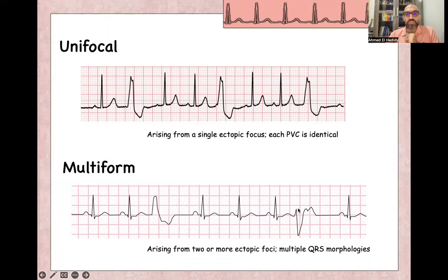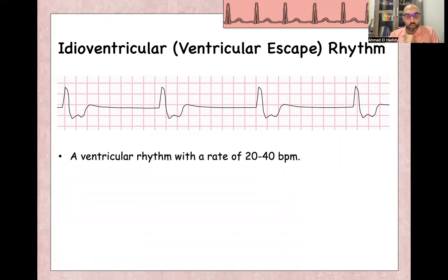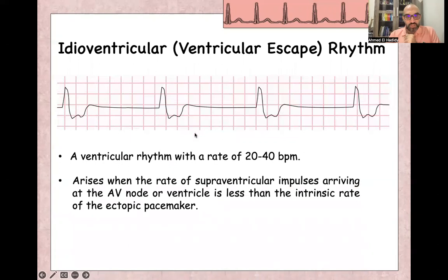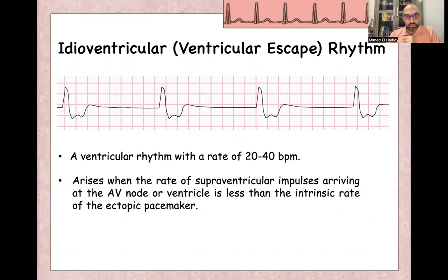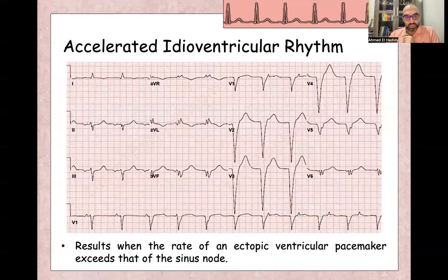Idioventricular escape rhythm means a ventricular rhythm arising from the ventricle itself with a rate between 20 to 40 beats per minute. It arises when there is failure of both the SA node and AV node to work as a pacemaker. The intrinsic fibers or muscles inside the ventricle will act as the pacemaker of the heart. The QRS will be wide, and you will find either left bundle branch morphology or right bundle branch morphology.